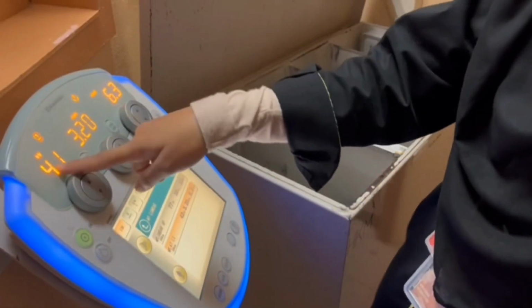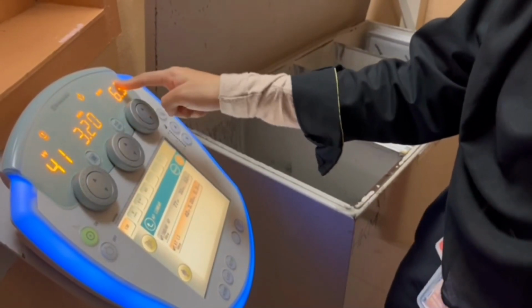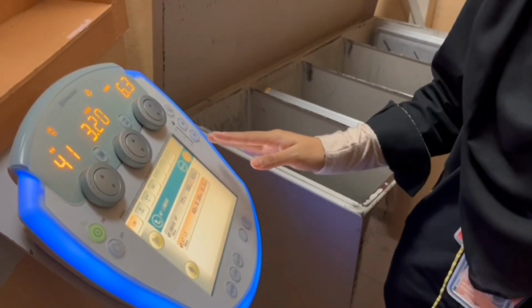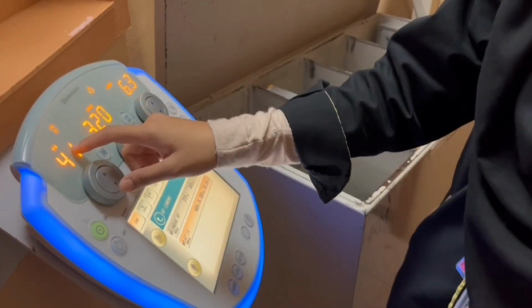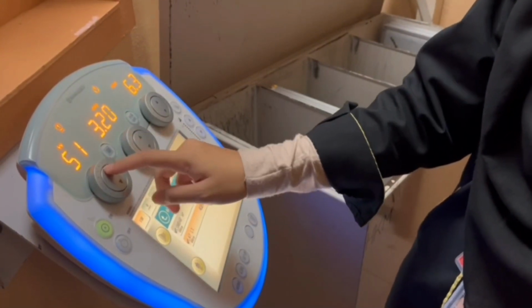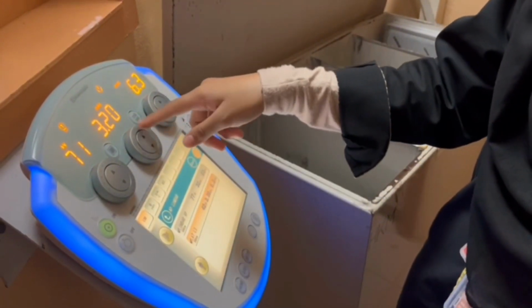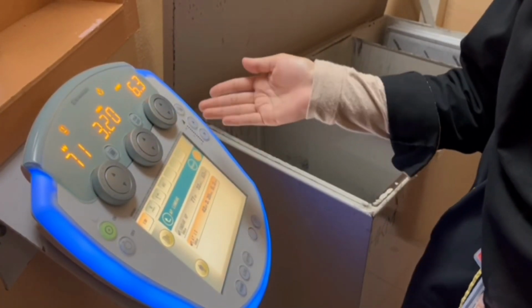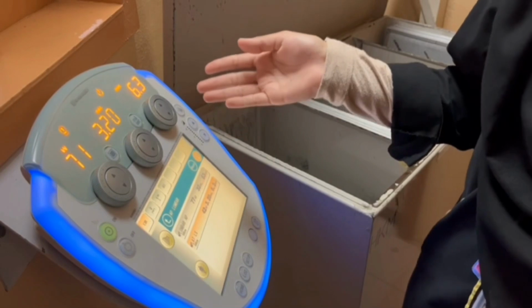Here, settings like voltage, current, and exposure time are adjusted to optimize image quality while ensuring patient safety. These factors are adjusted for different body parts and the condition of the patient. For example, this is usually the amount that we use to X-ray a patient's chest.